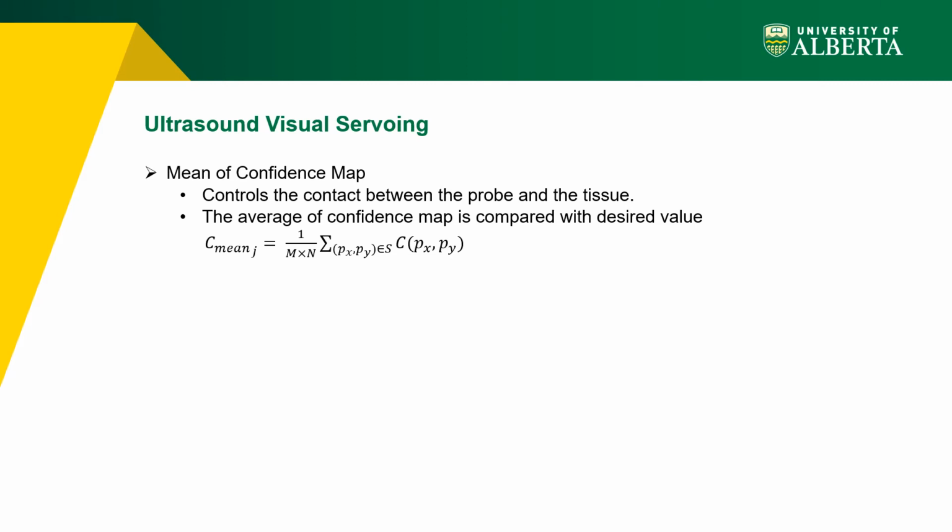The US confidence map is commonly used in image processing methods. It is a per-pixel measure calculating the probability of a random walk starting from each pixel to reach a number of virtual transducer elements under specific US constraints. This method considers the image as a graph where nodes represent the pixels and edges interconnect the nodes. We implemented 4-connected neighborhoods for each pixel node in the confidence map.